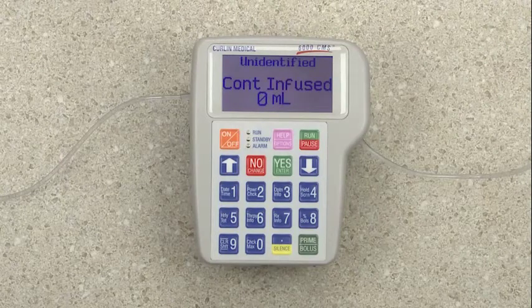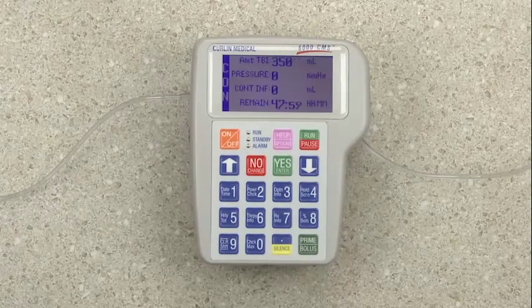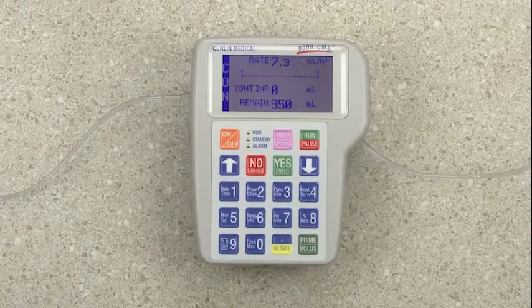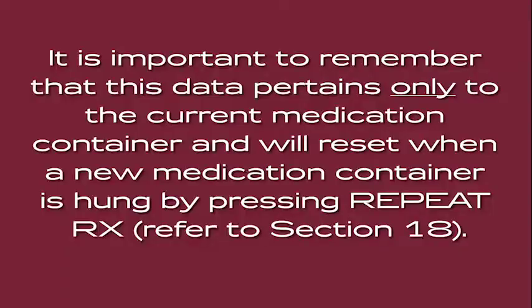The toggling run screen appears, detailing infusion information pertaining to the current medication container or the current infusion. It is important to remember that this data pertains only to the current medication container and will reset when a new medication container is hung by pressing repeat prescription. Refer to section 18.